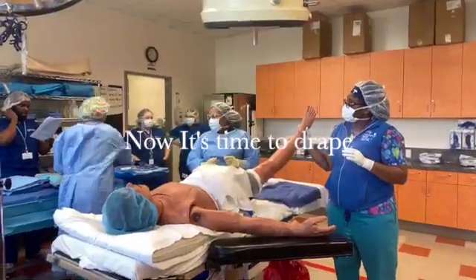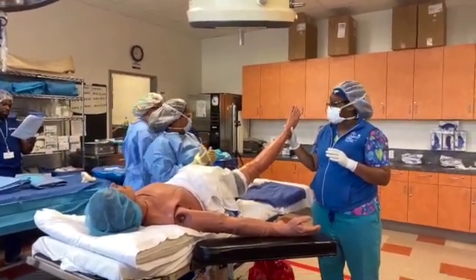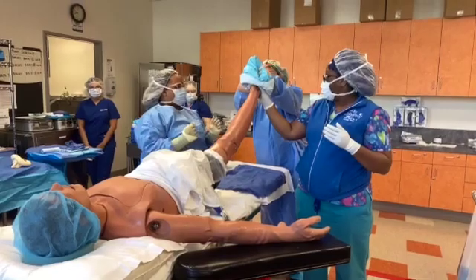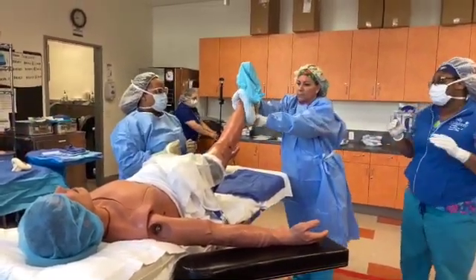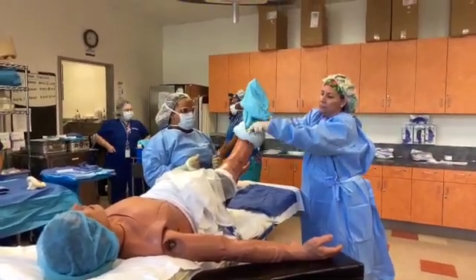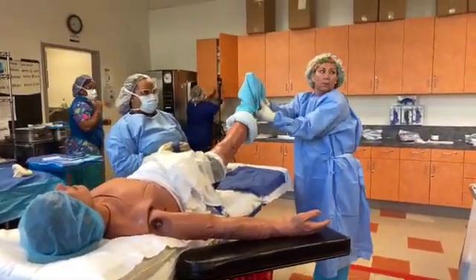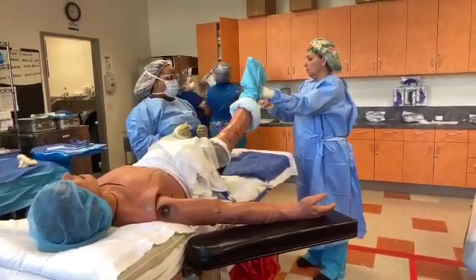Stockinette and correctly unfolds it towards the knee, stopping 4 to 5 inches below the patella. Secures the stockinette using Coban bandage. All right, doctor, you got it? Got it? Yes. Okay. You guys saw that. I did not let go until she was secured. So let me get, my hands are in the cuff. Can the other surgeon actually roll down the stockinette? Yeah, I'm gonna become the second surgeon real quick.